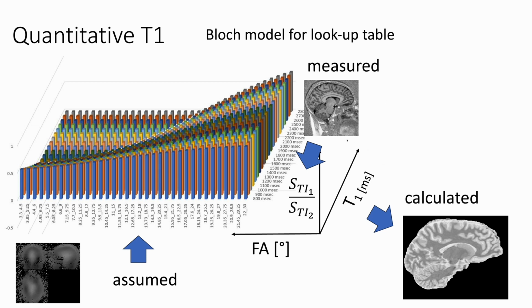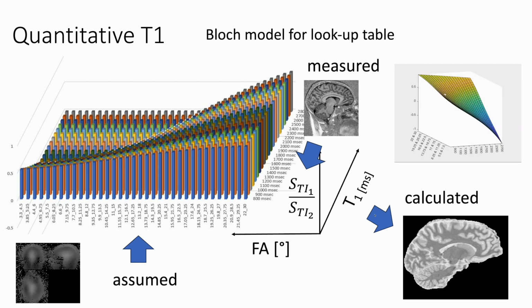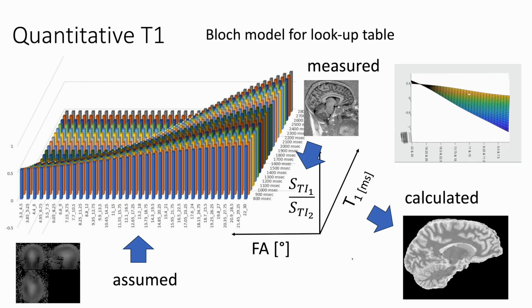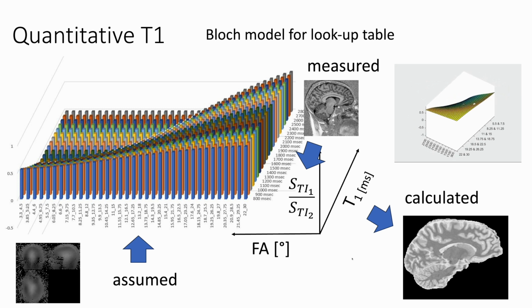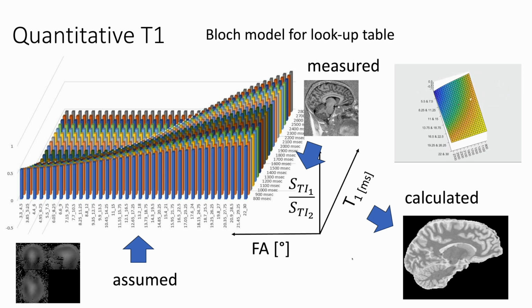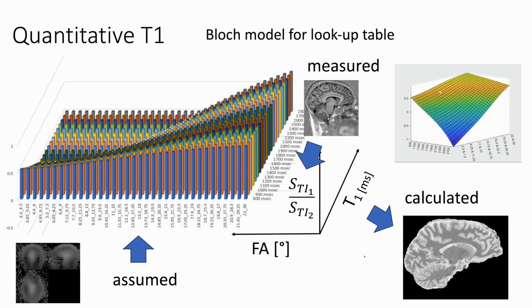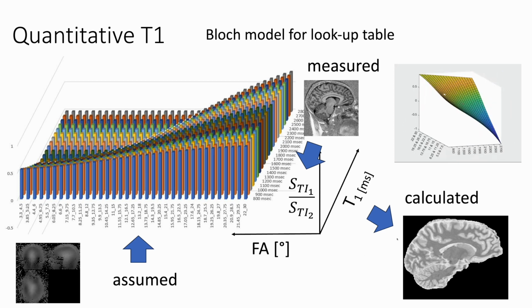And this is also a little video that Kenny generated, because in this table, you cannot really see that the columns are going negative on the other direction. So the 2 points here, maybe you can see them, are the gray matter and white matter, where you can see we are on this hyperplane, and depending on the flip angle that we are using, you can separate those 2 points further or less. We don't want to go to too small flip angles on the right side here, even though we have a larger contrast, because there we also have larger noise. So the 2 points are the ones with the best contrast to noise ratio.